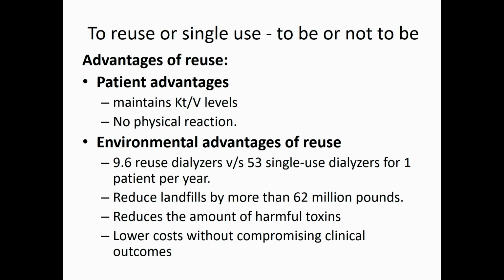Unfortunately, all the automated systems are supposed to give you a prompt when the fiber bundle volume has fallen below 80%, and it is not supposed to fill disinfectant in that situation. Unfortunately, this can be bypassed. And invariably, there is a nexus between the patient, some of the unit staff, and the engineer of that company. So he is told, please bypass that step. And so irrespective of what fiber bundle volume is there, the disinfectant is filled by the machine, and it is reused.